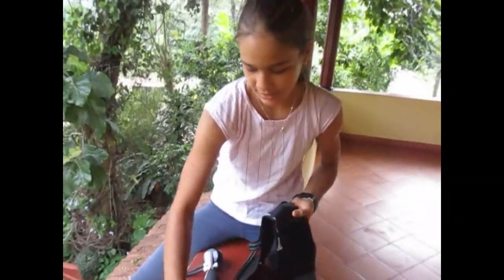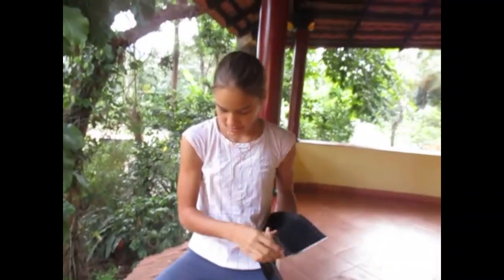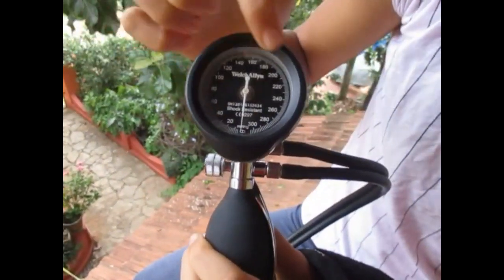So what you would need is a stethoscope — this thing which you put in your ear — and then you can hear the pulse by putting the chest piece onto the pulse. You also need this blood pressure measuring monitor. This is the cuff which goes around your arm, this is the pump where you pump in the air, and here you can see how much pressure it is — it goes up to about 300.